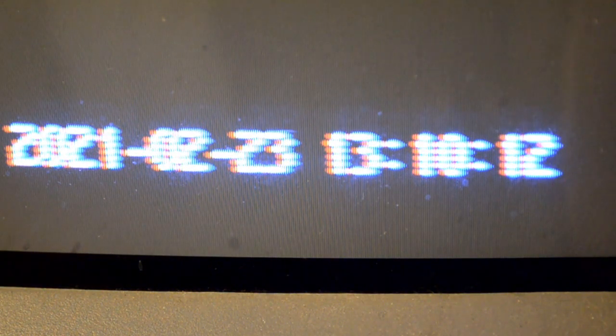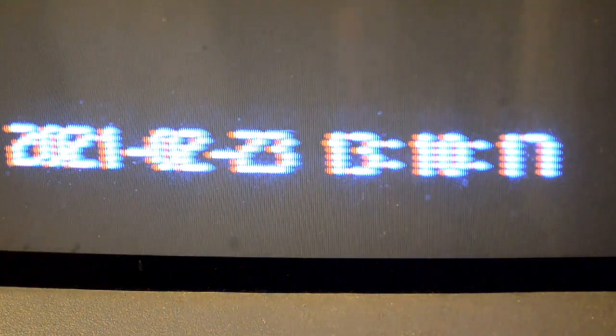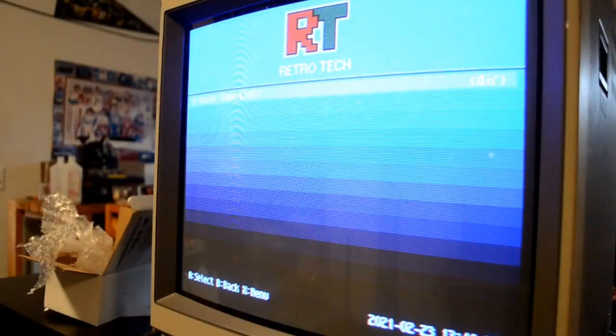And then we've also got the clock down here on my display. Again, this is just running from a program, but the reason I'm showing it is you could see an enormous amount of convergence in this corner, where on my camera, you can literally see the red lines separated from the green and the blue there on the bottom. So that's all stuff we're going to need to repair and tighten up.